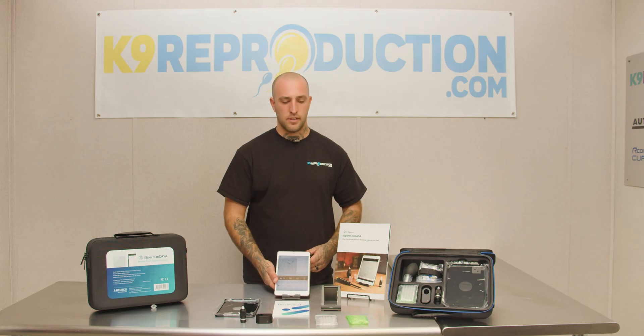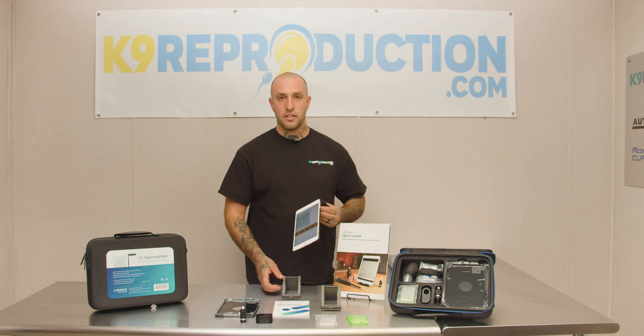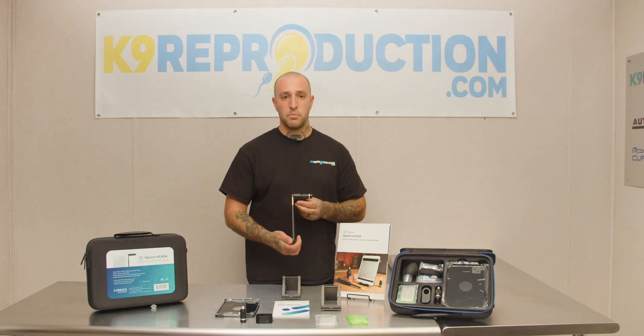Some of the key components of this kit include your iPad stand, your iPad case, your heater to keep samples at optimum temperature, and your light source.